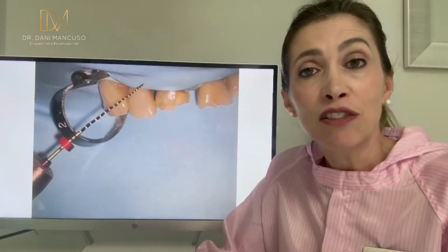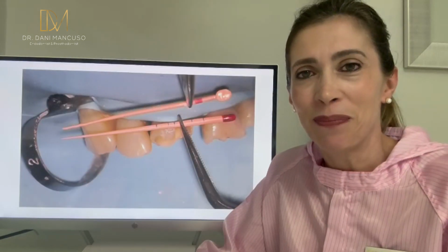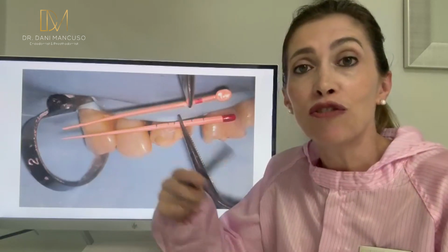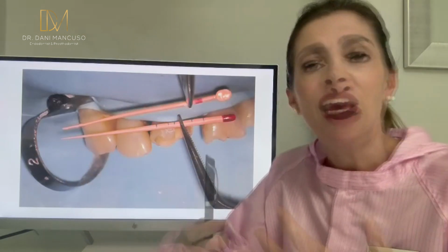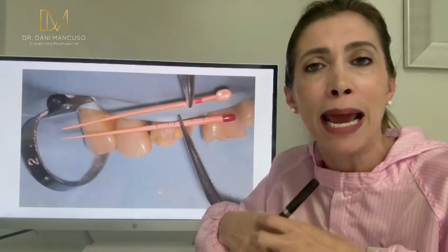So now the Trunatomy, preparing the canal, and choosing the GP. In that case, it's better to use the Trunatomy. Why? Because the 25.04 I had in my drawer was so thin apically that I wanted to give a bit more pressure for my sealer to flow apically.